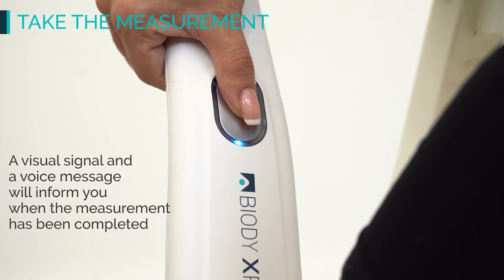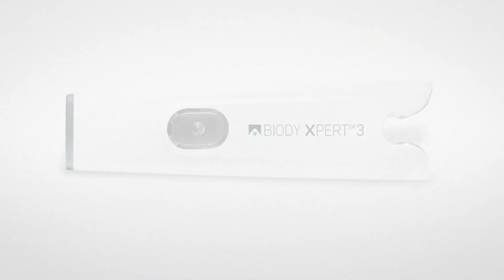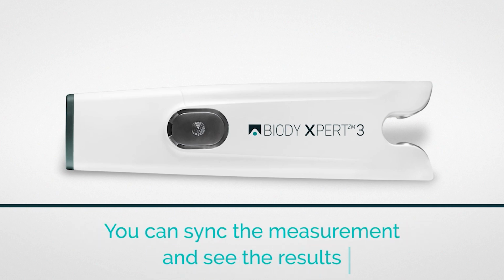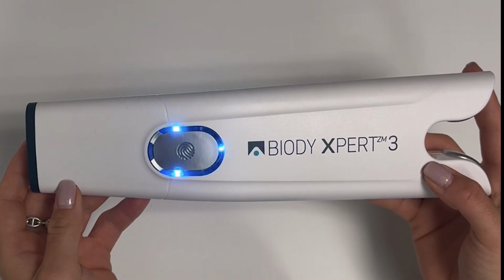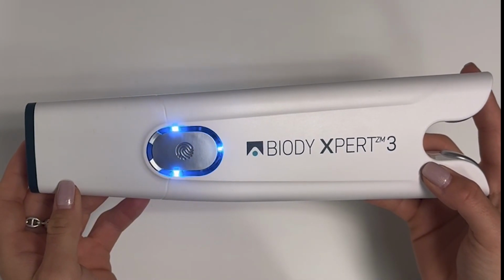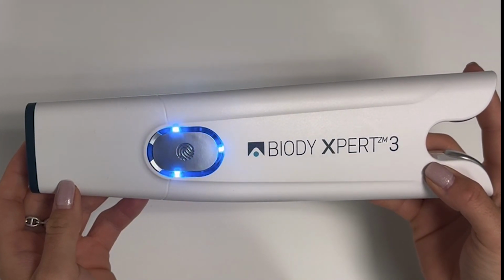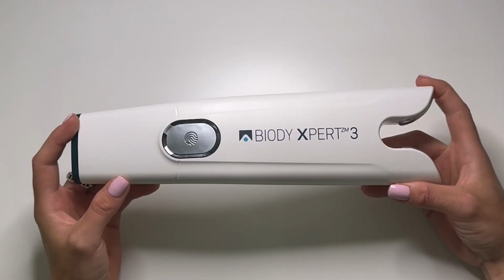The measurement is finished. Bluetooth communication enabled. You can now sync the measurement and see the results. When the measurement is complete, the device indicates that it is ready to pair via Bluetooth. You have 1 minute to proceed with the measurement. Otherwise, your measurement is saved in the device.